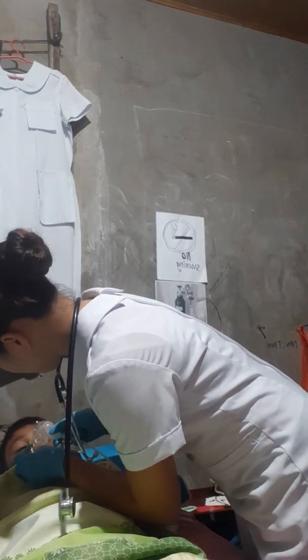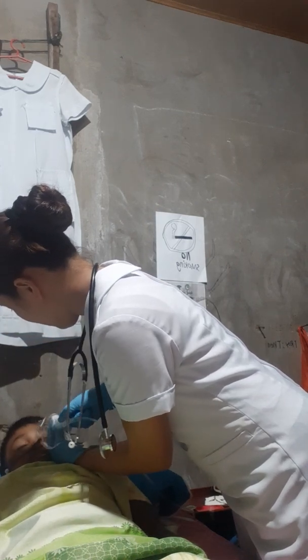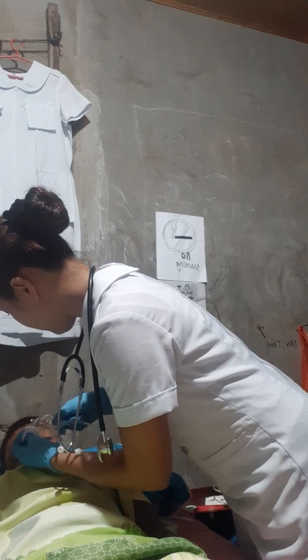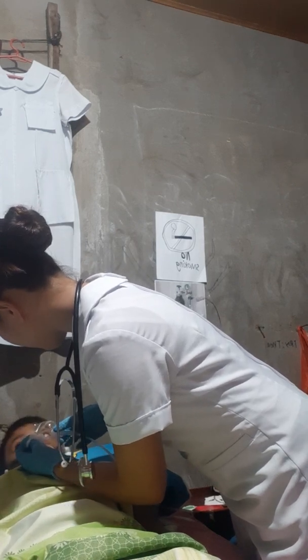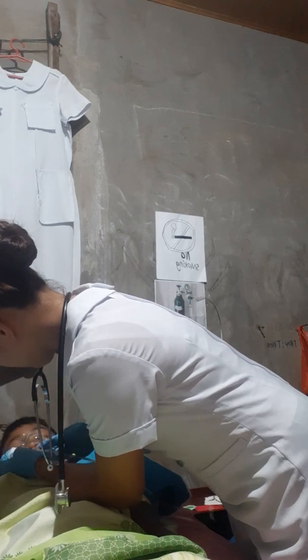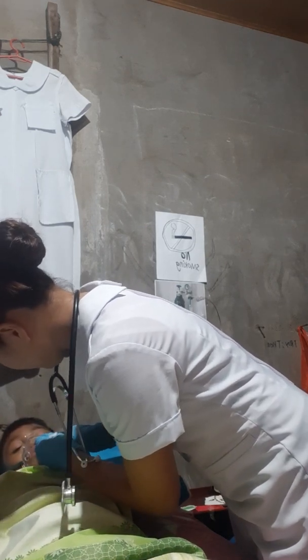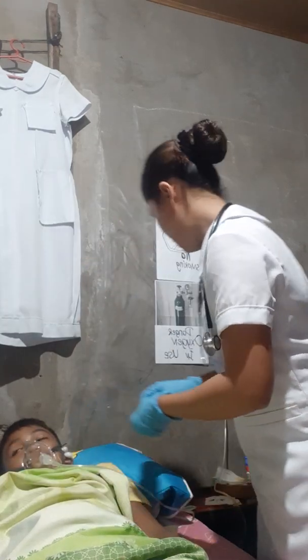Excuse me, sir. Then, assess the nares every 8 hours according to agency protocol or recommendation. Then, assess the nares for evidence of irritation and bleeding.